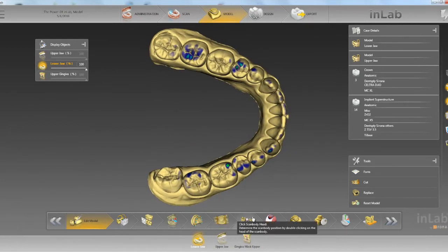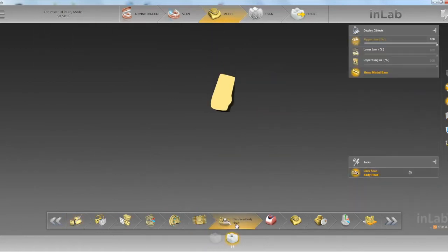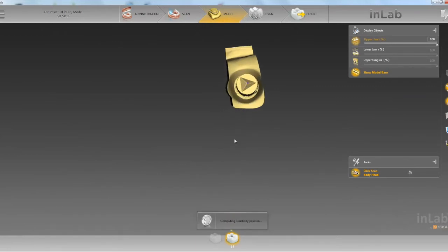Next, if you have an implant that you're doing, you want to get to the click scan body head and go ahead and click on the scan body head.